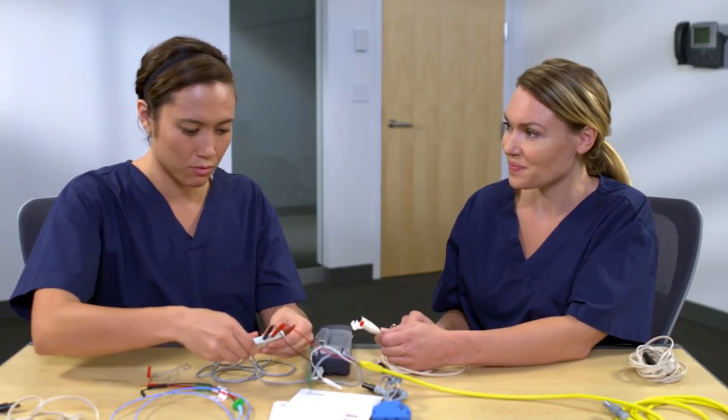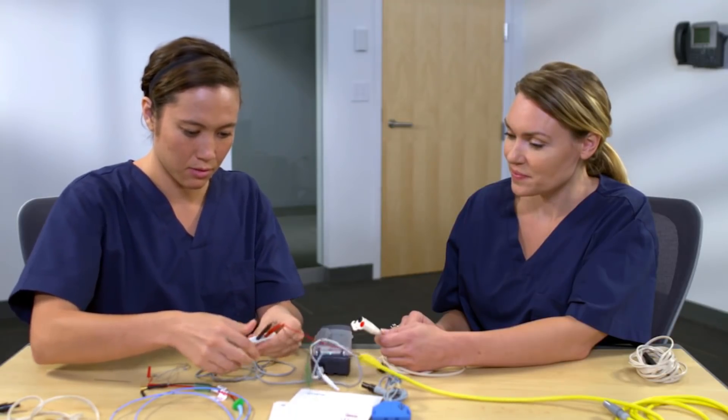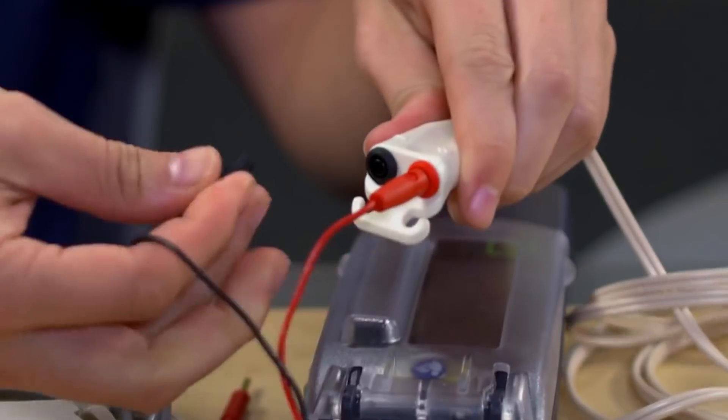Go ahead and connect to the 5846. I'll get my shrouded pins available, match the red to the red and black to the black.